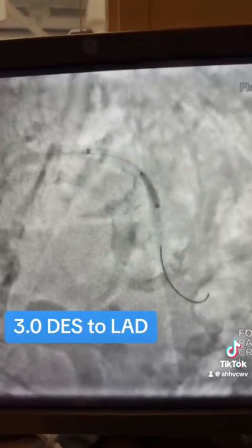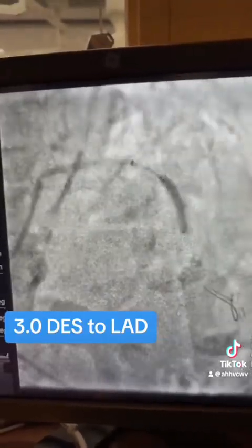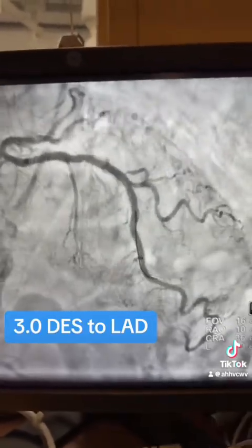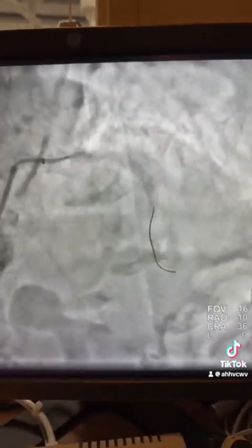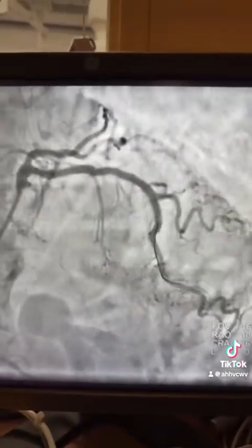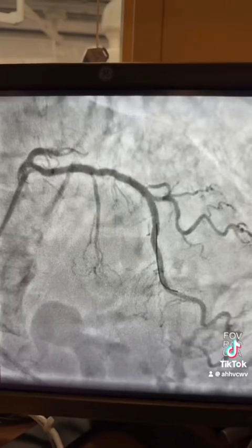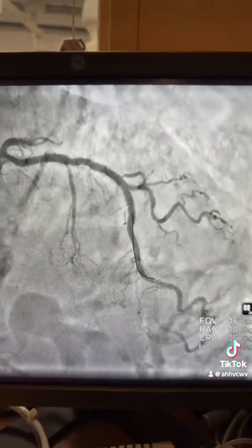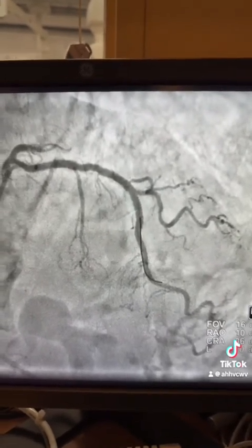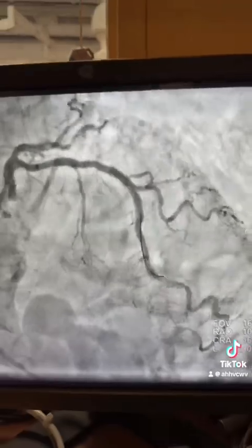Once the balloon is inflated, advance the Guideliner with the balloon inflated, then advance it distally. Here is the Guideliner distal — once you have it distal, placing the stent will be easy. Stent in the LAD, and here is the final result: very nice, decent results in the LAD and even the diagonal — you don't have to put a stent, the outcome is perfect. Thank you very much.